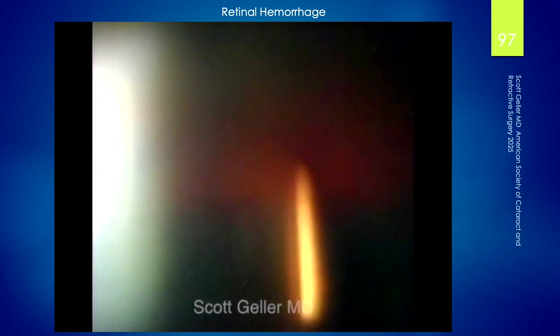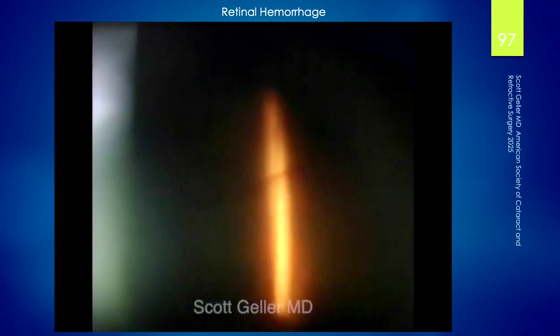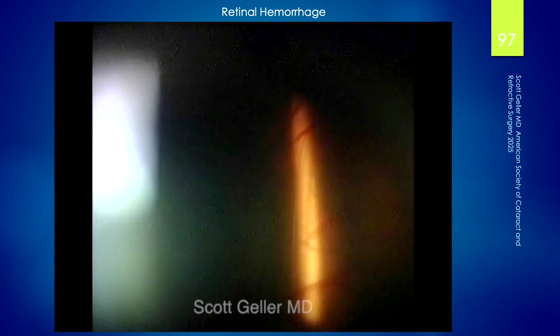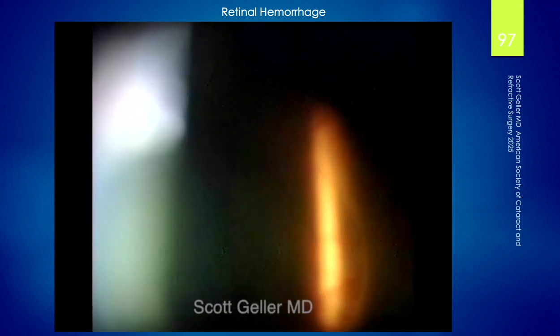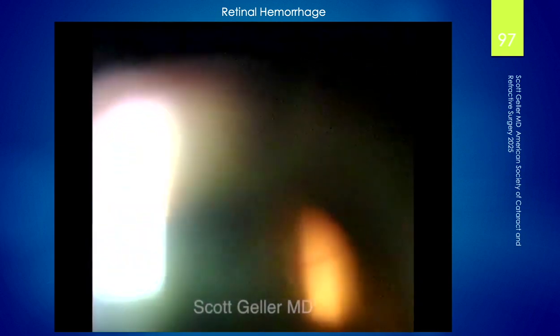And by the way, you take off the contact glass very carefully because when you take off the glass, you'll be putting negative pressure. And if there is a nice little clot that sealed the retina, you don't want to disrupt that. So ultimately, patient came out just fine. And my cardiac status was okay as well. But isn't that fascinating? I stopped the session then.